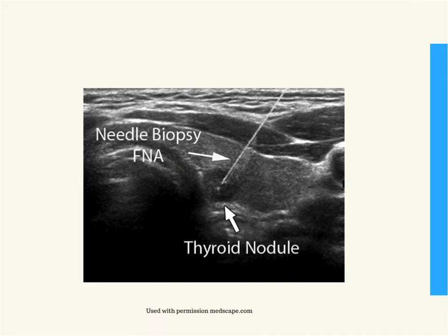Here we can see a real-time image of the dual use of ultrasound-guided fine needle aspiration. We can see the needle going through the anterior neck musculature, into the thyroid gland itself, and into the suspicious thyroid nodule.